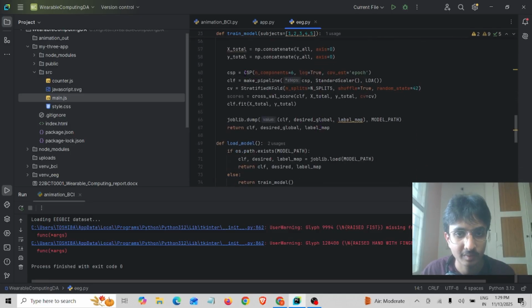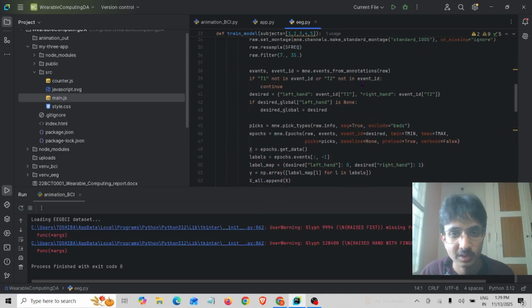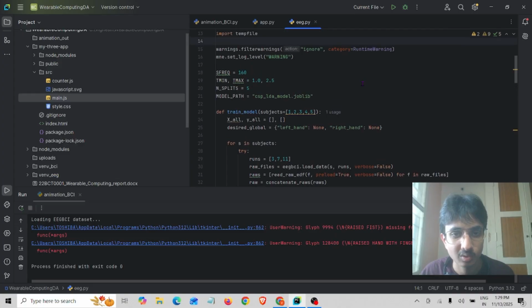As you can see, we are using a pipeline to schedule the tasks. CSP will be used to extract the features from the dataset, and LDA will be used to differentiate between different motor activities, say left hand and right hand. So you can see the code clearly.